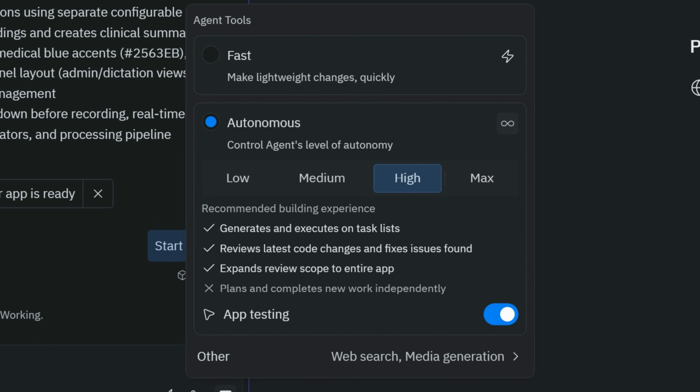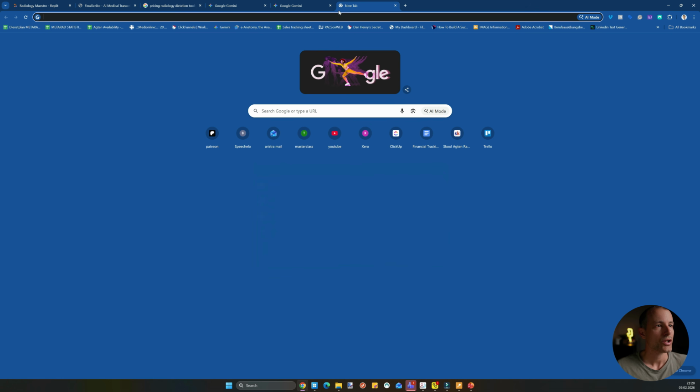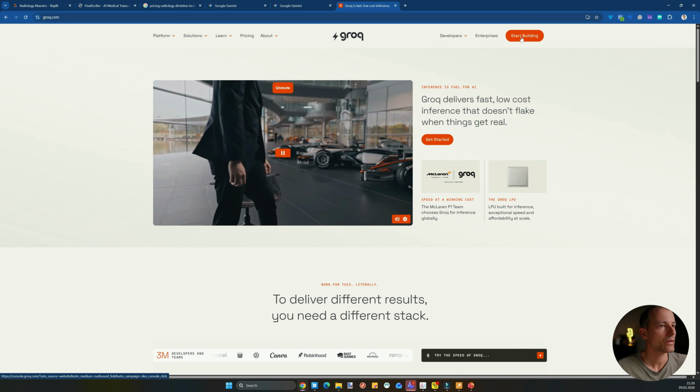I'm going to go here to the settings. I have the agent as autonomous, high. However, I'm going to disable app testing because I haven't had good experiences with this. It just hangs up. It doesn't really know how to test things. So we just do this, but I leave it at high. Later we can go down to maybe medium, but for our purposes now, high is going to be the best thing. So what we can do in the meantime is go to groq.com because we need an account. We can start building.